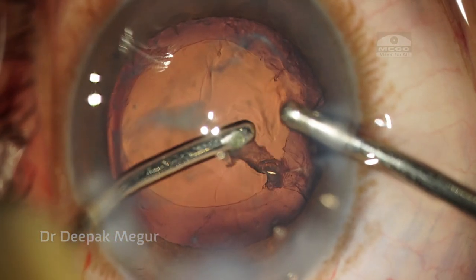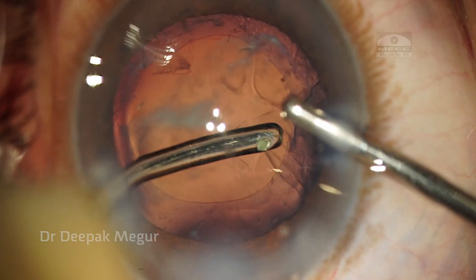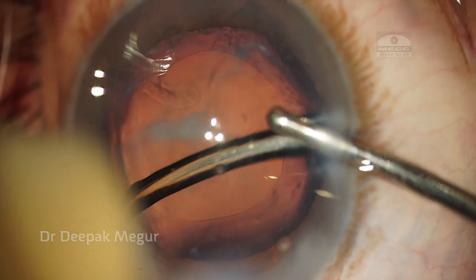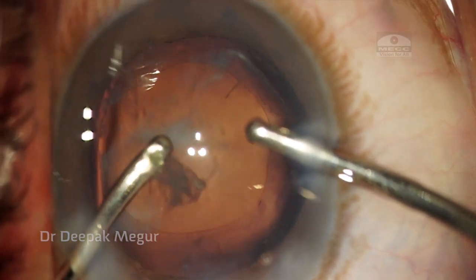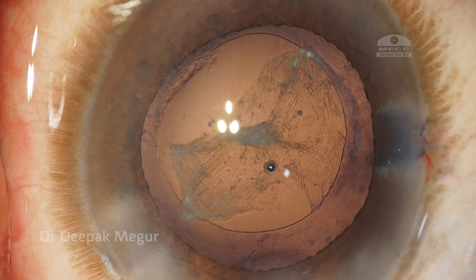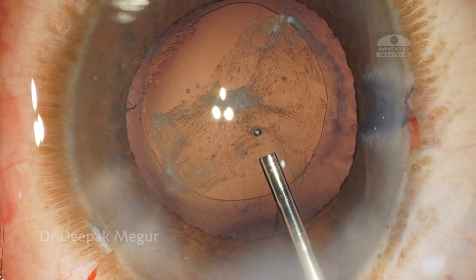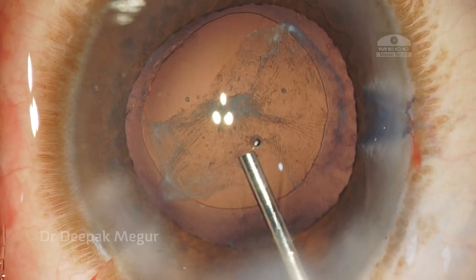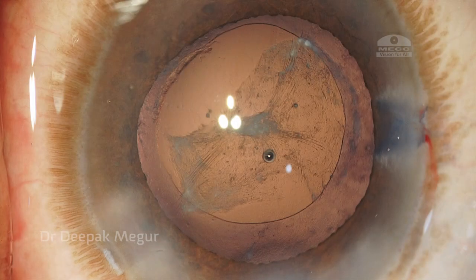I'm thinking whether to deal with this posterior plaque now or later. I decide to do a primary posterior capsulotomy at the primary setting, hoping for early visual rehabilitation. Because it is a calcified capsule, I thought forceps might not be the best option, so I resort to doing this with my cutter.